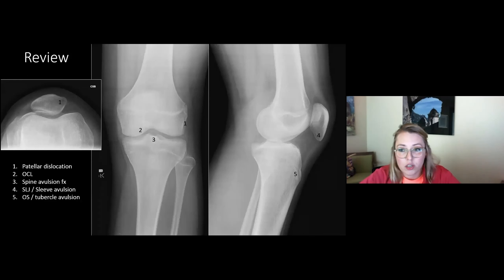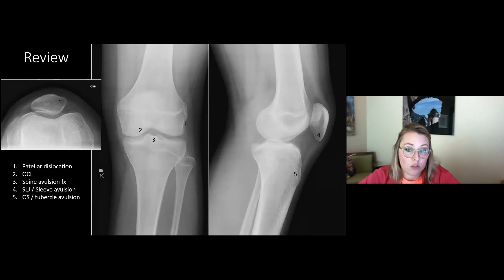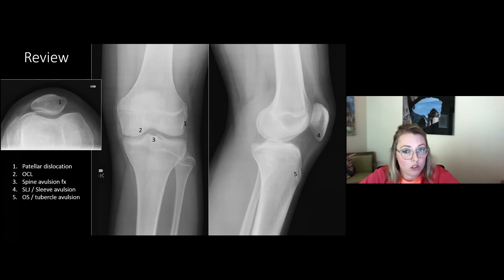To review the radiographic search pattern for the pediatric knee: (1) The medial patellar facet and lateral femoral condyle — bone injuries from patellar dislocation-relocation. (2) The central medial femoral condyle — osteochondritis dissecans and osteochondral lesions. (3) The tibial eminence — eminence avulsion fracture, the ACL tear equivalent. (4) The inferior patella — acutely for patellar sleeve avulsion fracture, chronically for Sinding-Larsen-Johansson. (5) The tibial tubercle apophysis — acutely for tibial tubercle avulsion fracture, chronically for Osgood-Schlatter disease.